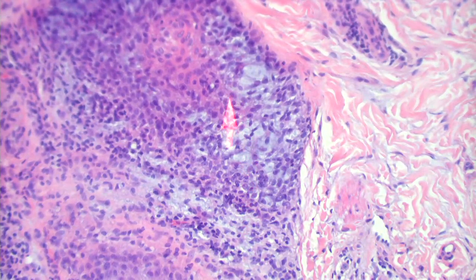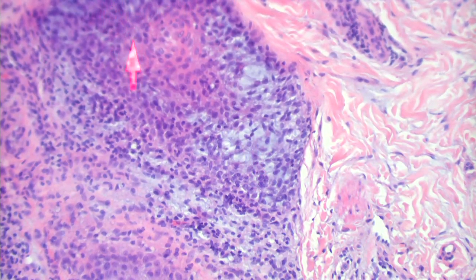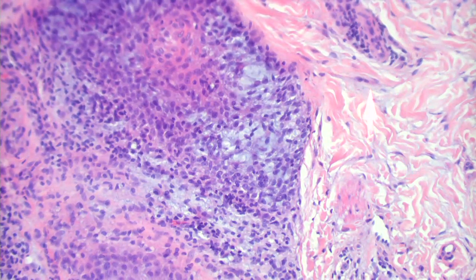You can see it as a reaction pattern in other things, occasionally atopic dermatitis, rosacea. Less common with lupus to actually get it in the follicle itself. Okay. The mucin in lupus is here, as opposed to here. This is a tiny, normal amount of mucin here. Is that the same chemical material as this? I would say probably not. Yeah, of course not. Whenever I ask the question that way, right?